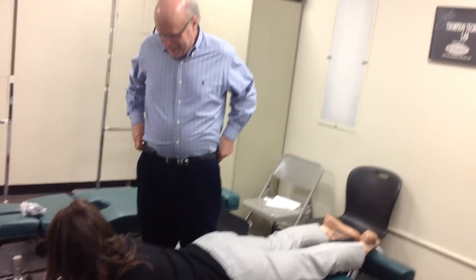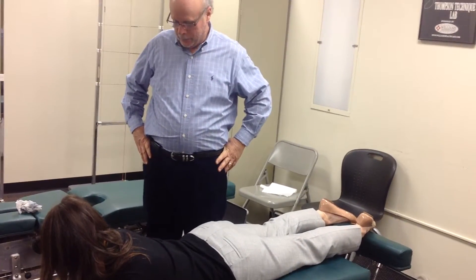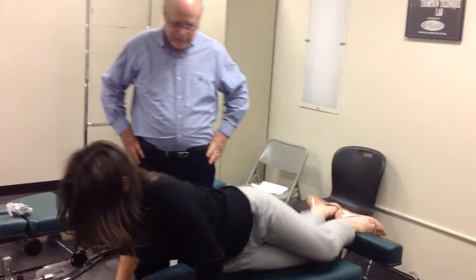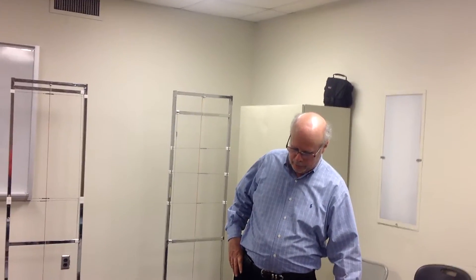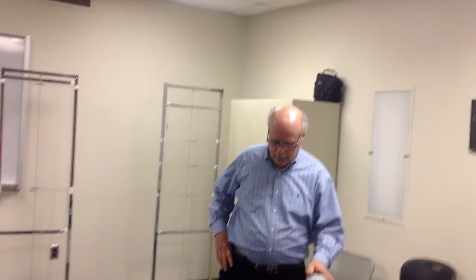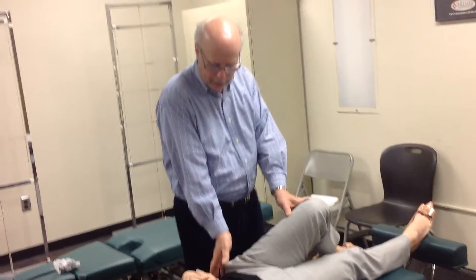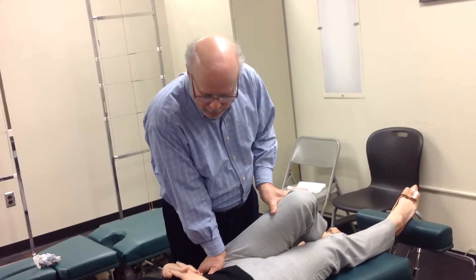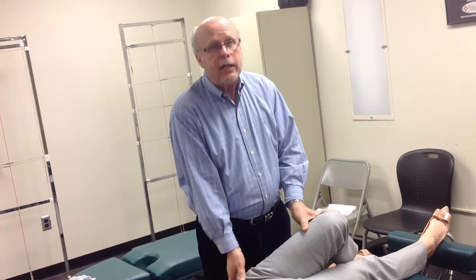Can you do the IN and EX setups? Okay, lie face up. I would have the sacral blocker in the pelvic piece. If she had an IN ilium here, I'd have her bend her knee, then I would open the IN by holding the ASIS on the table and thrusting anterior to posterior through the ASIS while the SI joint is held open.